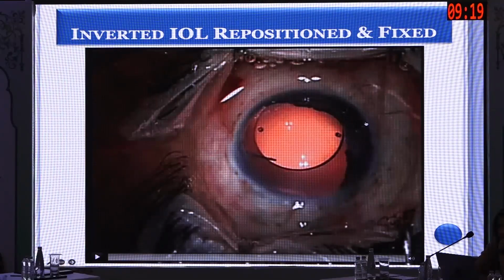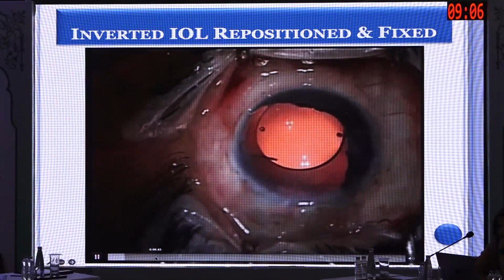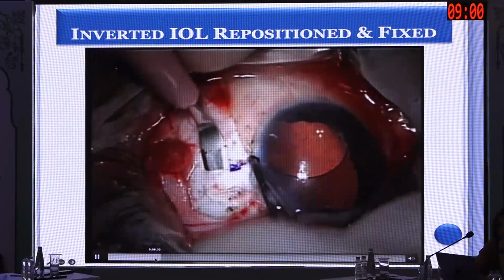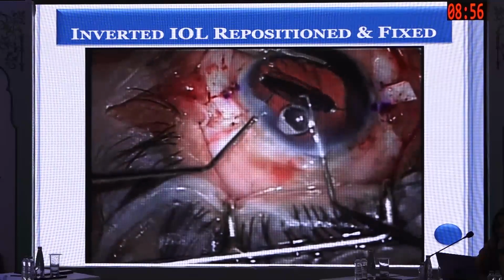There is no capsule visible. It is getting caught. It is caught in the uveal tissue, I guess. And the patient had recurrent uveitis glaucoma, and the patient had a lot of symptoms. So initially, the patient was given steroid. I didn't want to handle it because it was stuck. But then after stopping the steroid, again the patient had this problem.